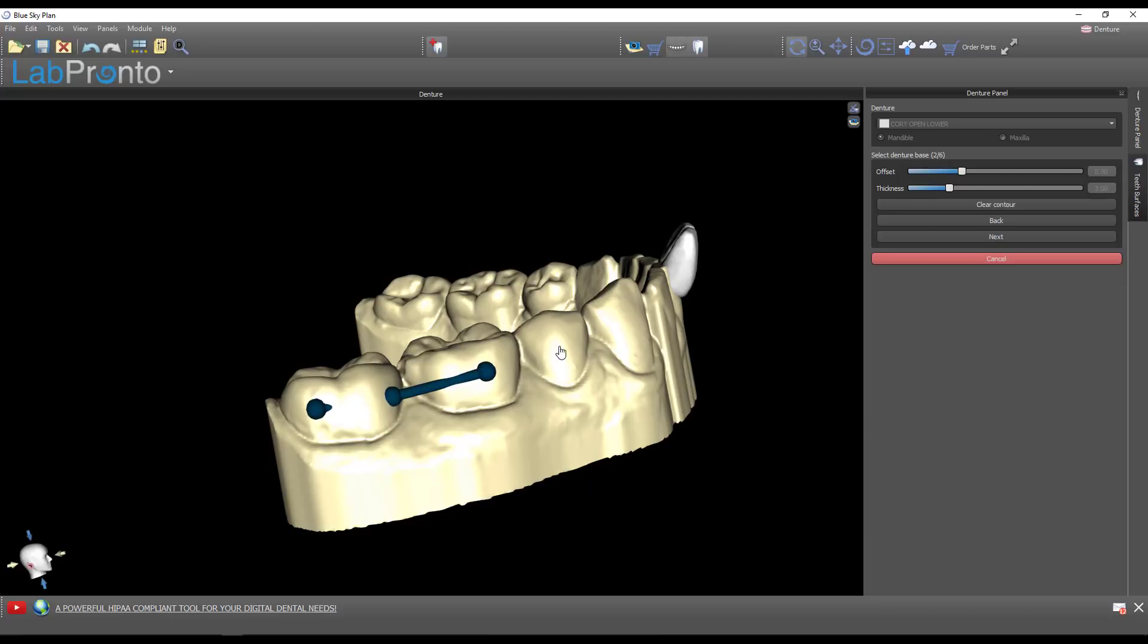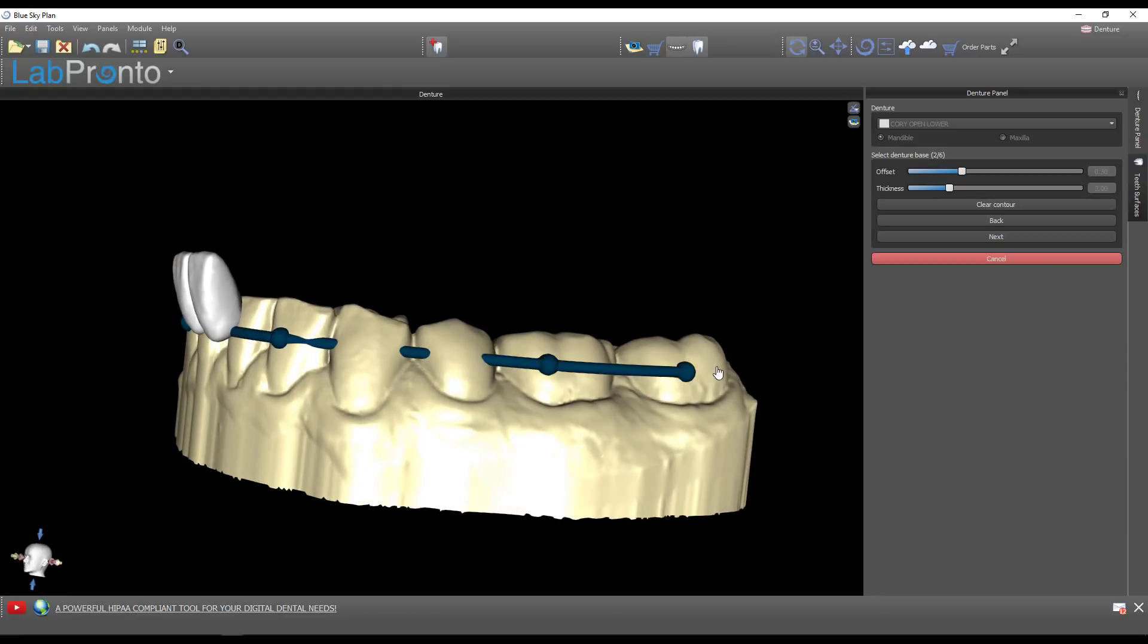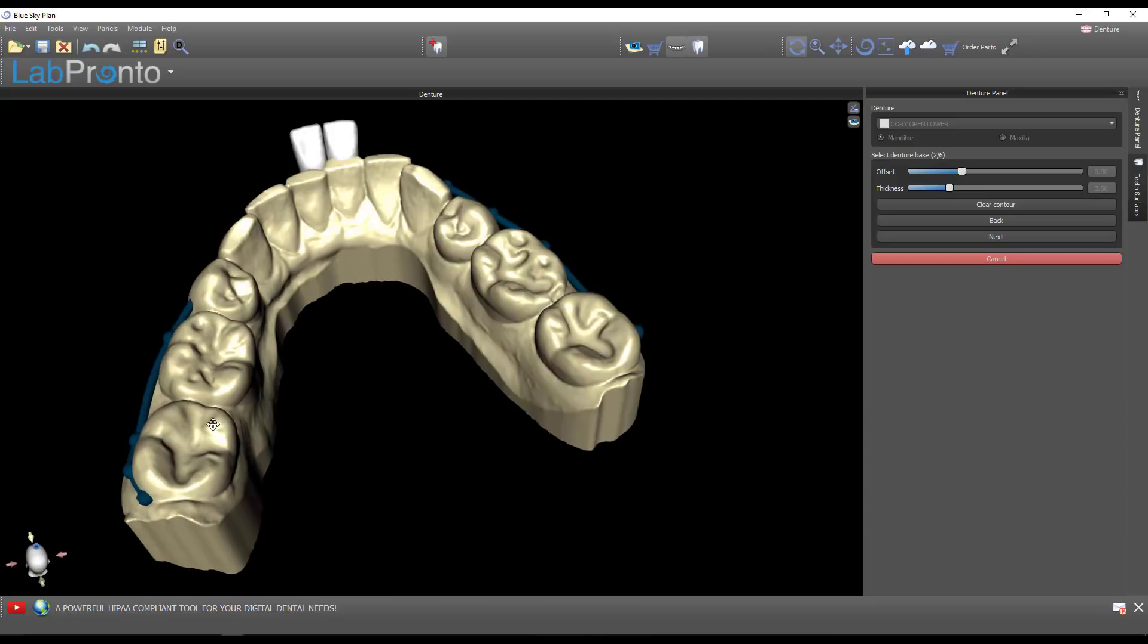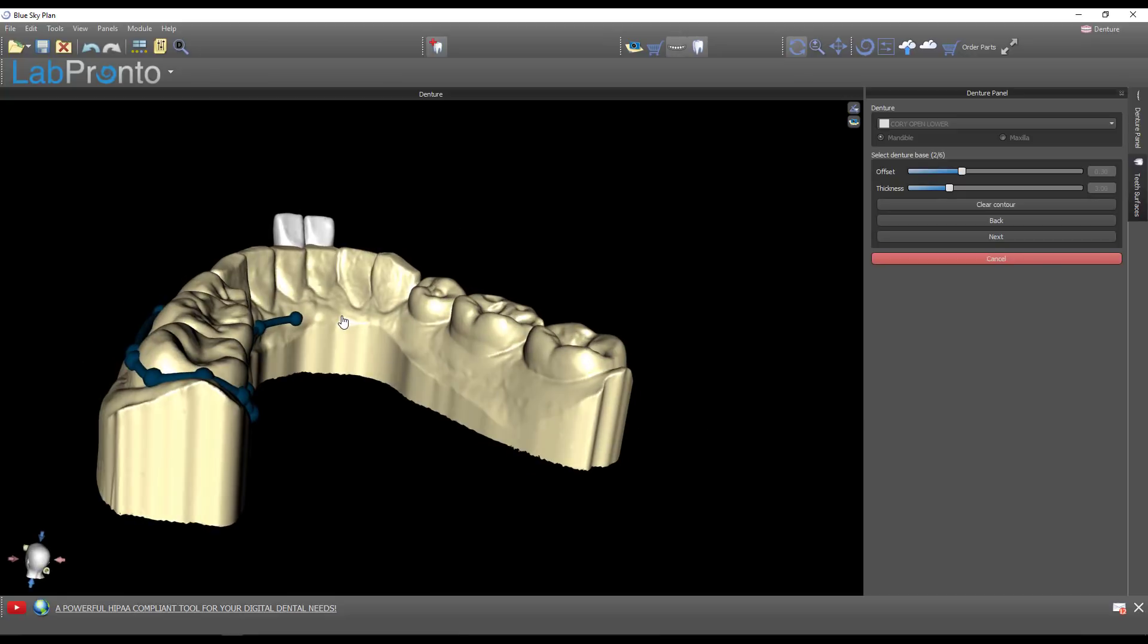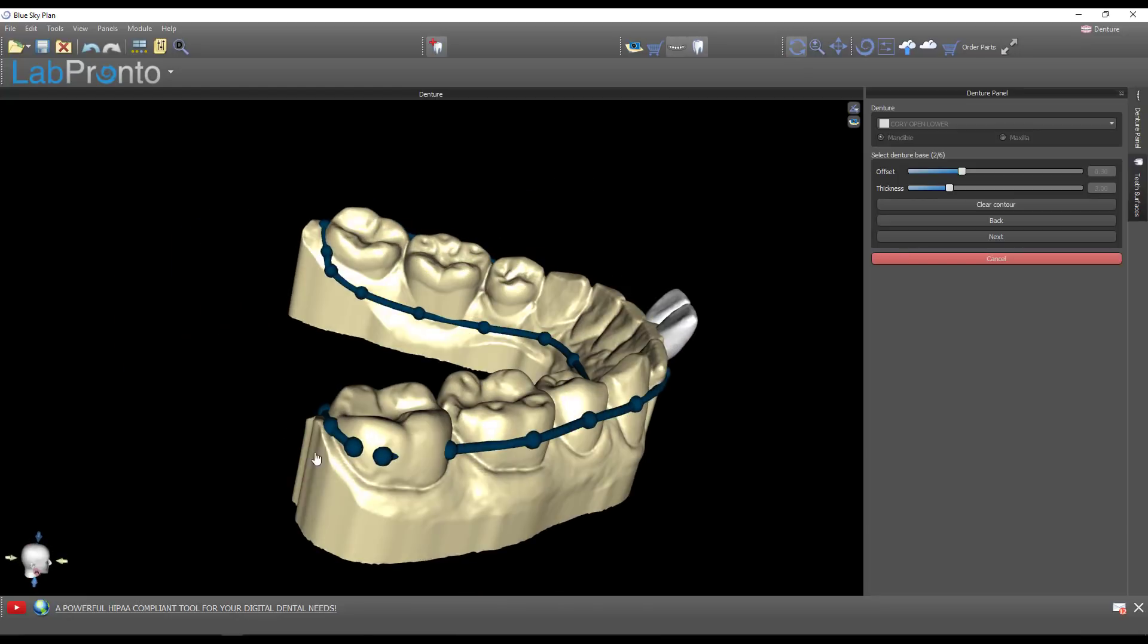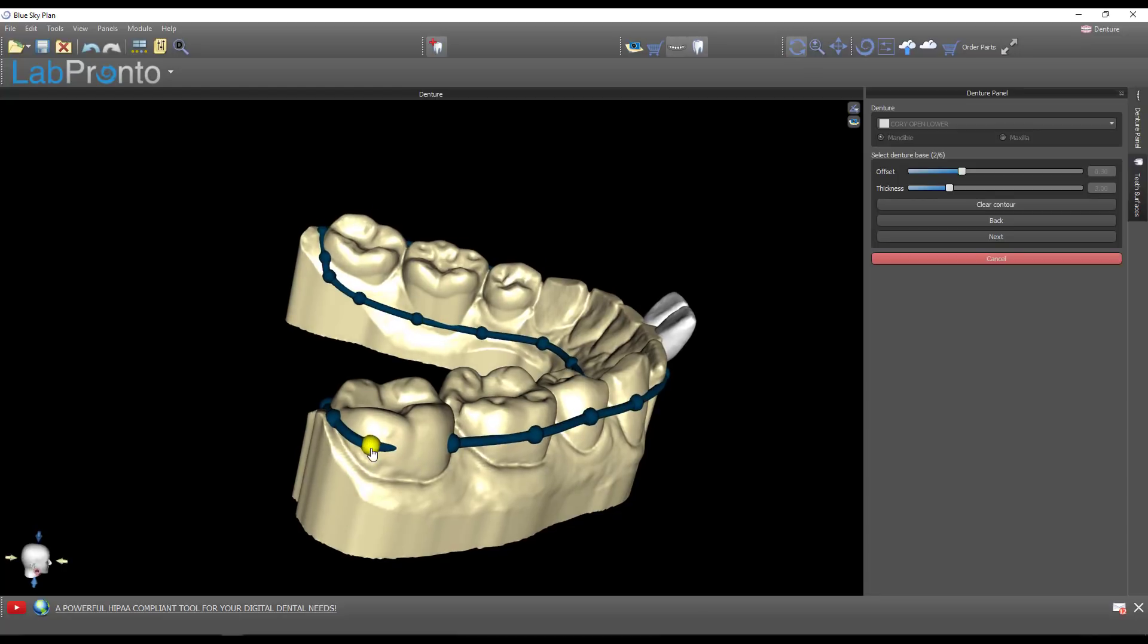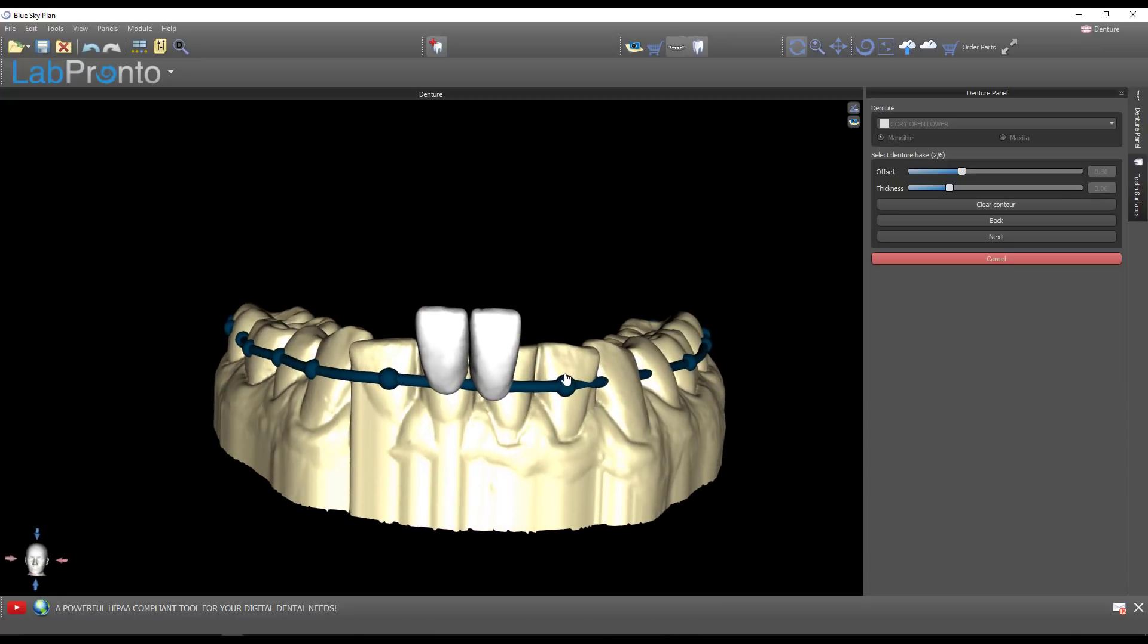Now it's asking me to select the denture base. We're not making a denture base, we are making a night guard. So draw the perimeter of how you would like this night guard to be. I'm going to go more or less halfway down the buccal surface, then wrap around the lingual. When you get to the last dot, drag it into the first one to close that contour. That's very important.